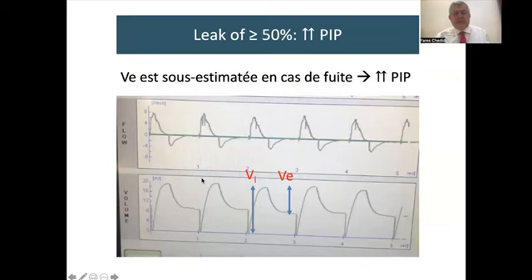As you can see here in this graph, this is a patient who has a leak because you see the inspired volume is the area under the flow. This is the flow, this is the volume. You see the area under the curve of the inspiratory flow is much bigger than the expiratory flow because there is a leak. What came into the flow meter during inspiration didn't come back due to a very big leak.